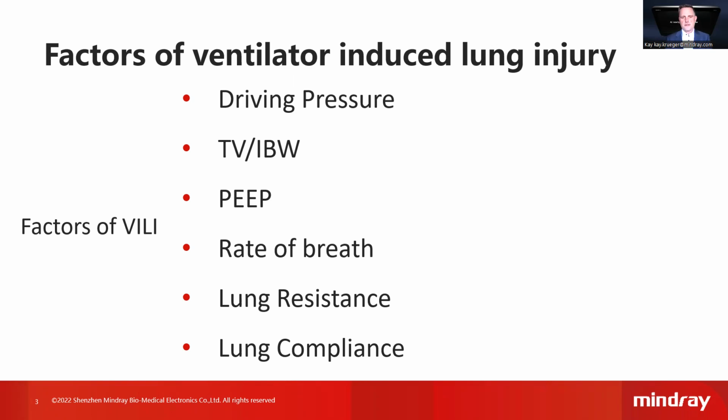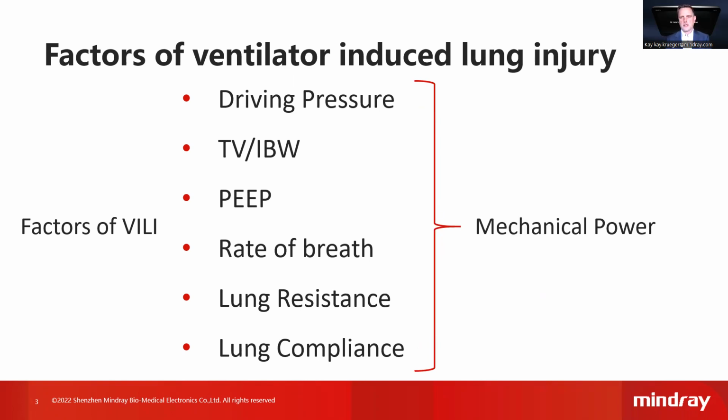There are several other factors that maybe need to be taken into account as well, which are the breath rate, the resistance of the lung, and also the compliance of the lung. And all of those factors together are taken into account when we talk about calculating mechanical power in mechanical ventilation for a patient.